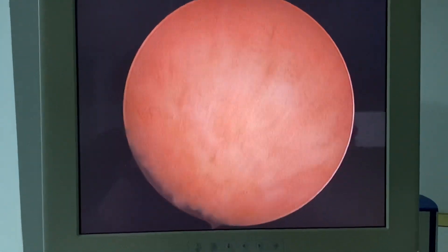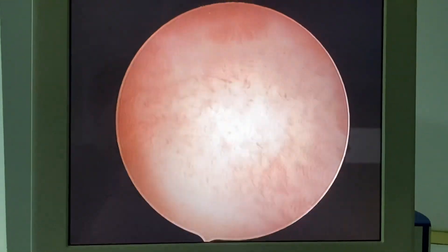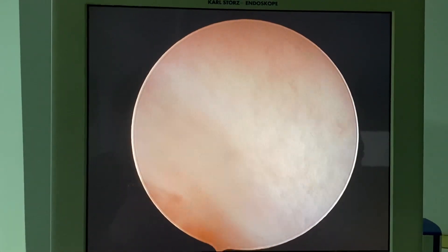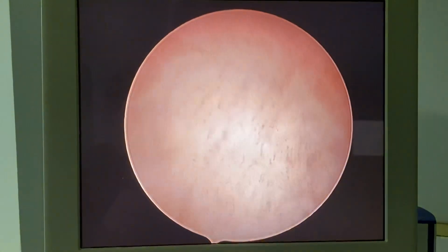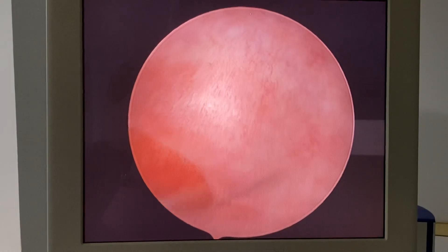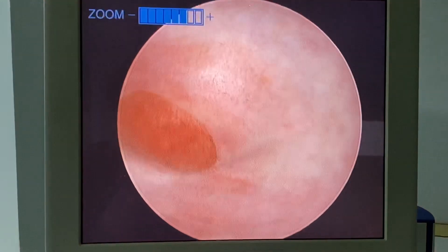Classic vaginoscopy is actually a vaginoscopic access to the uterine cavity. Later on, I thought that we could provide a different and more objective procedure: just press on the vulva to distend the vaginal canal, and that is the real vaginoscopy.